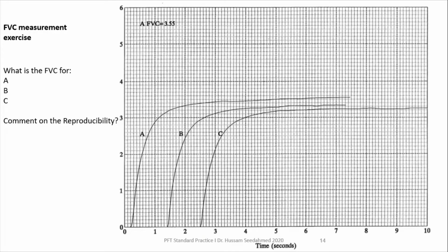So I'll give you 30 seconds. Check these curves and determine just the FVC: how much is it for A, B, and C, and comment on the repeatability.